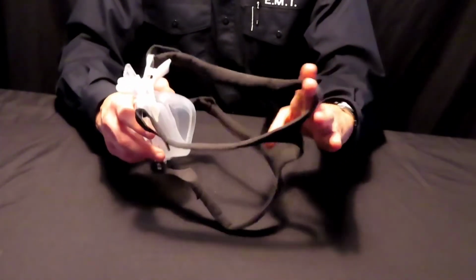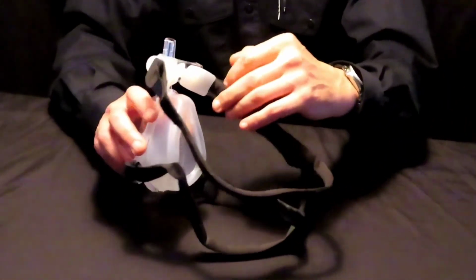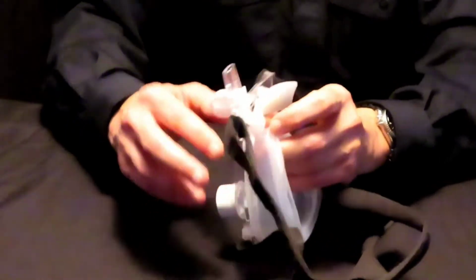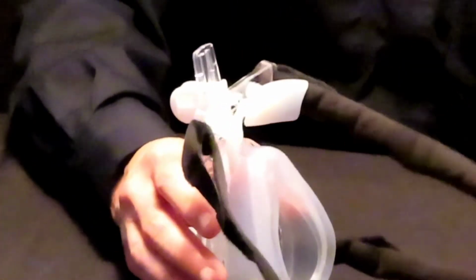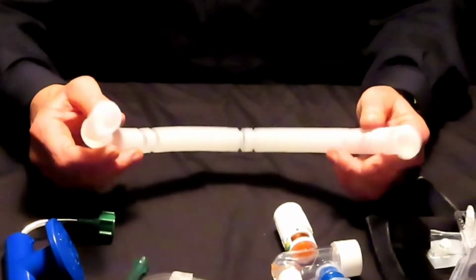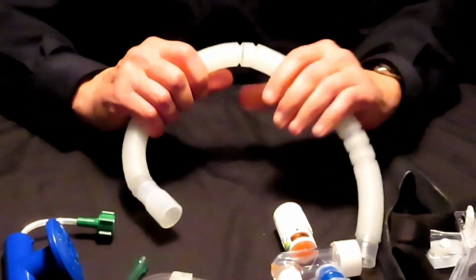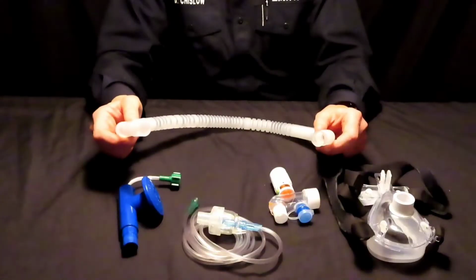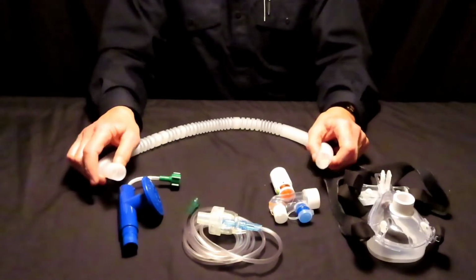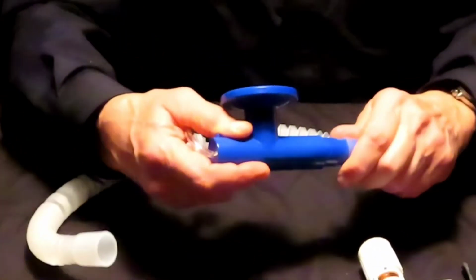There will be various head straps to attach the mask, as well as Velcro adjusting straps and an adjustable temple tab to adjust the pressure on the patient's face. Inside the CPAP kit, you will also find a corrugated hose. This hose can be expanded as required to stretch between the patient and the oxygen supply. Into one end of the corrugated hose, insert the flow restrictor.